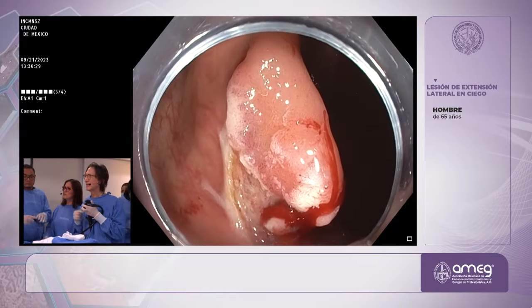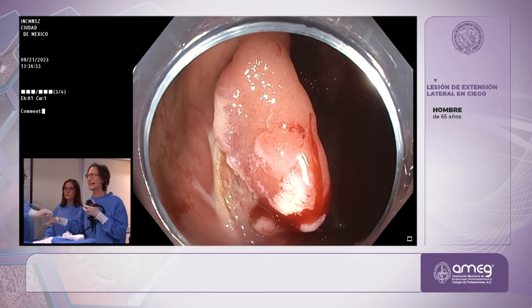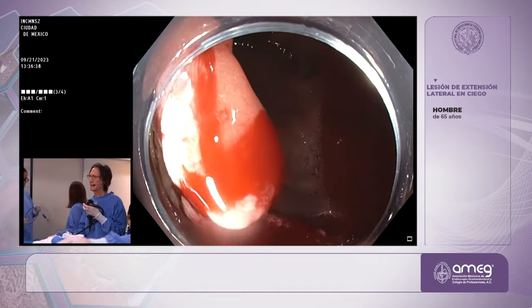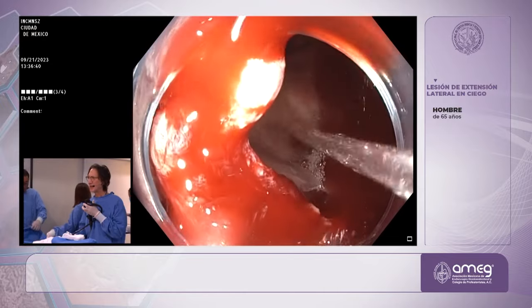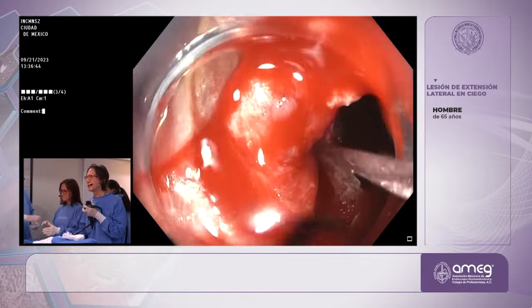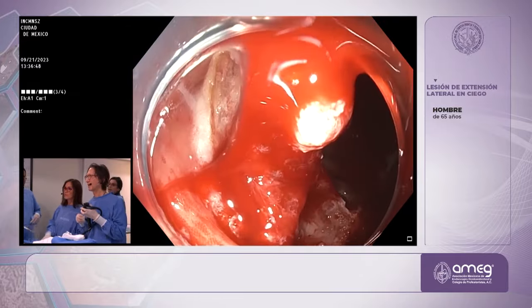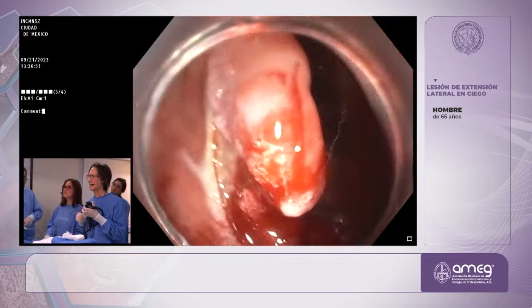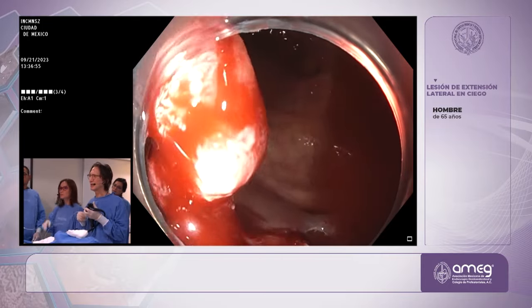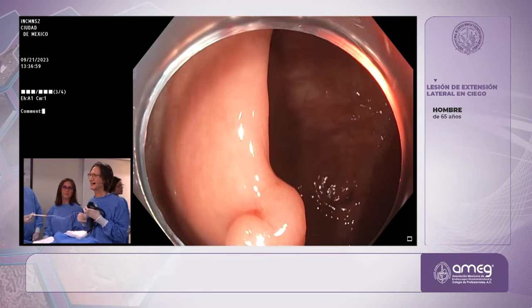So let me now have the... So I couldn't get the whole lesion en bloc. I wanted to, but I got most of it. So this one I can get the rest en bloc. Let me have the 25, please. Elasa. So we have a little bit of oozing here. So this is the part that I resected. But I'm going to ignore this right now. And often the bleeding just stops on its own, if you wait a little bit.